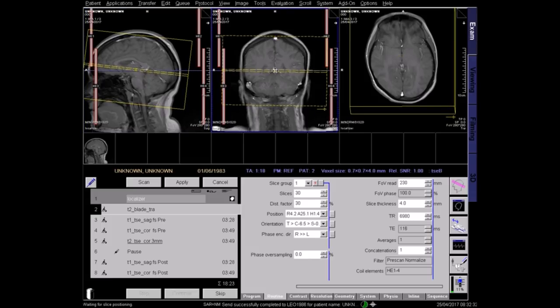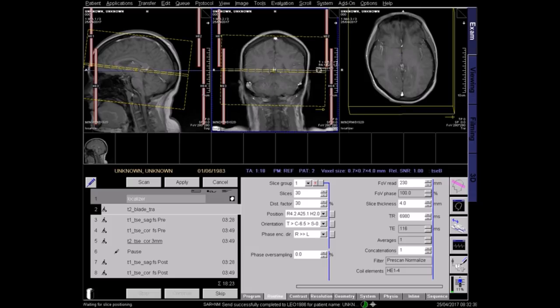On the coronal localiser, the central slice should pass perpendicular to the midline of the brain. Check the field of view in the axial plane, and apply.